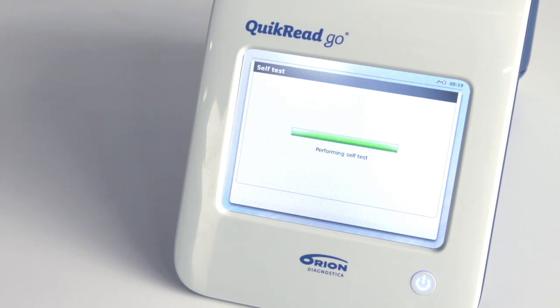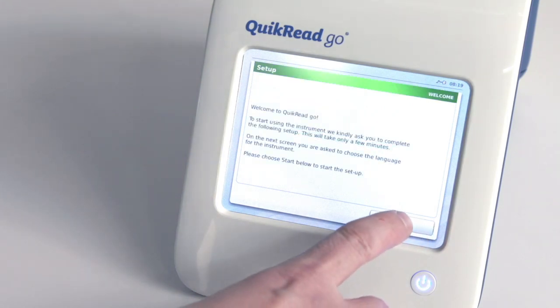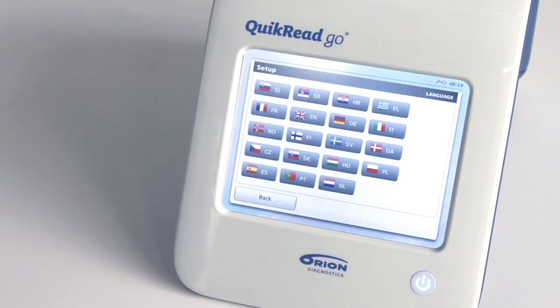Next you will be asked to complete a setup wizard for selecting the language and the date and time. Start the wizard by choosing Start on the touch screen. Follow the instructions given on the screen.